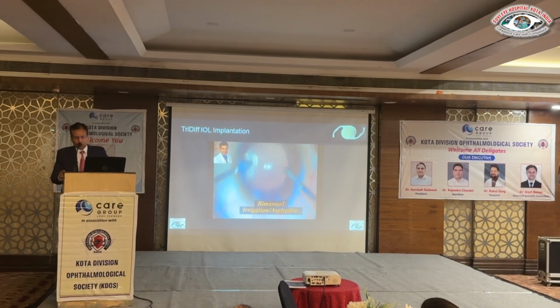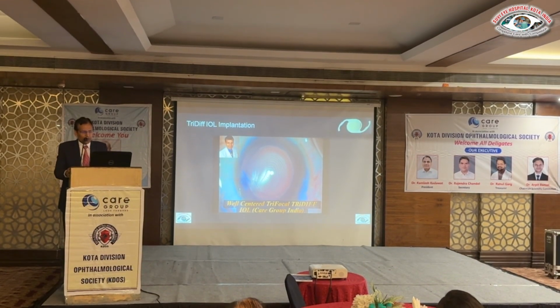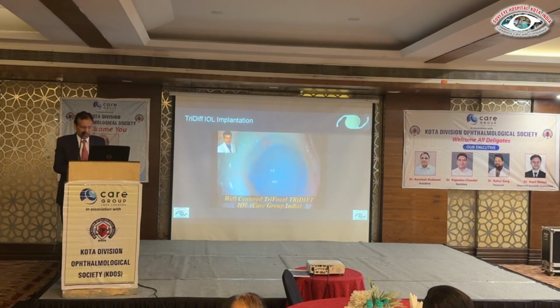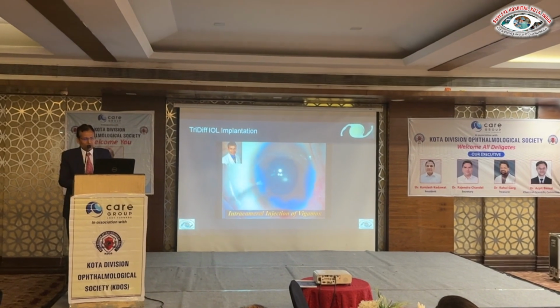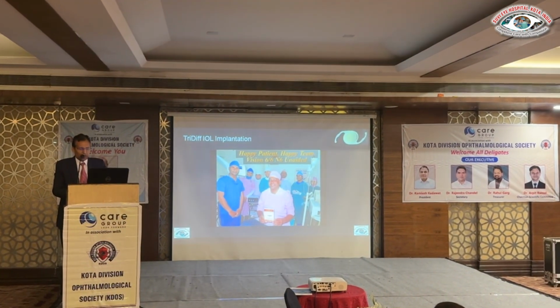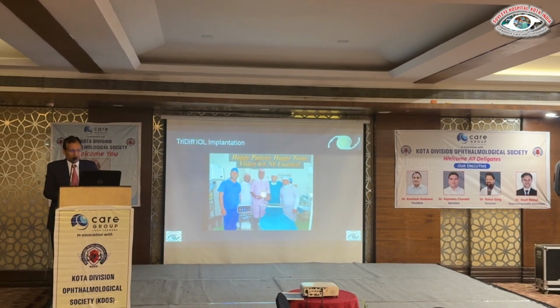So once you implant the lens, then you can remove the viscoelastic behind the lens, and you can see the lens is well centered. I prefer to use the triamcinolone and intracameral moxifloxacin, and you can see this is the perfect surgery and with perfect visual outcome, and the patient was able to read the newspaper the next day after surgery.